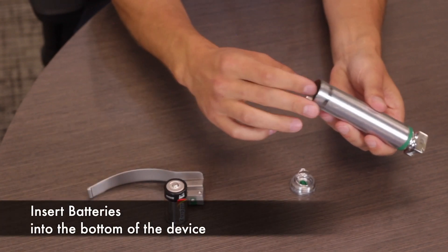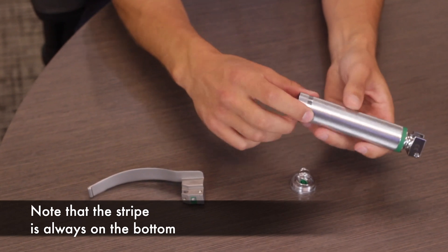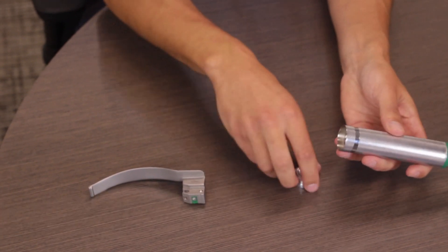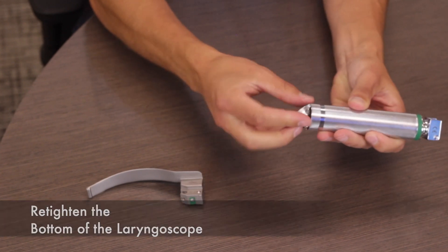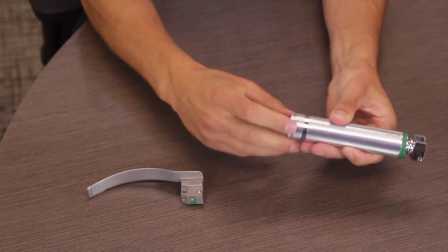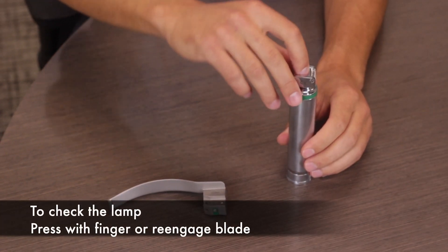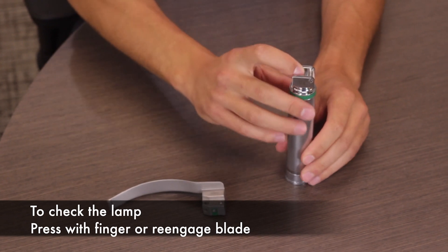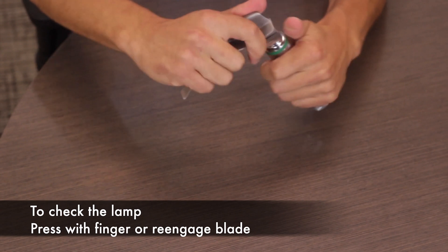Reinsert both batteries at the bottom of the device. Note that the stripe is always at the bottom of the laryngoscope handle. Lastly, retighten the bottom of the laryngoscope — it's now ready for your next intubation. We always recommend double-checking that the lamp is functioning properly. You can check with your finger or by reengaging your blade.